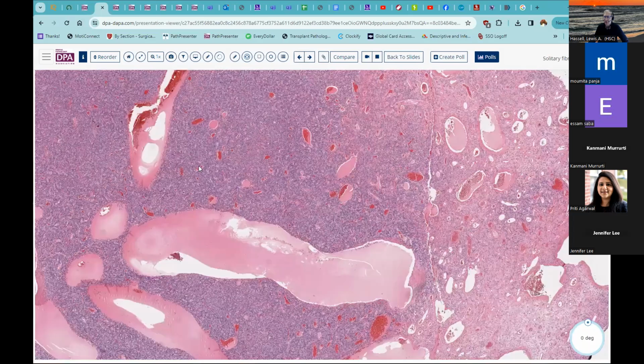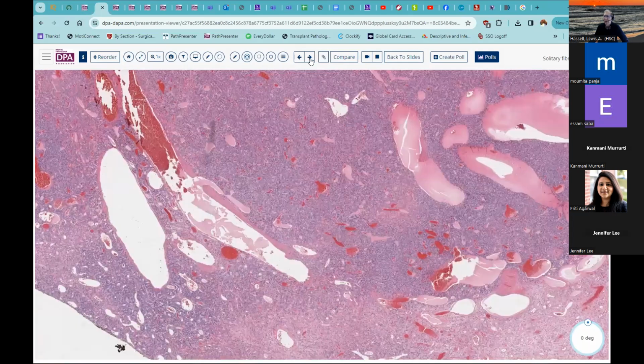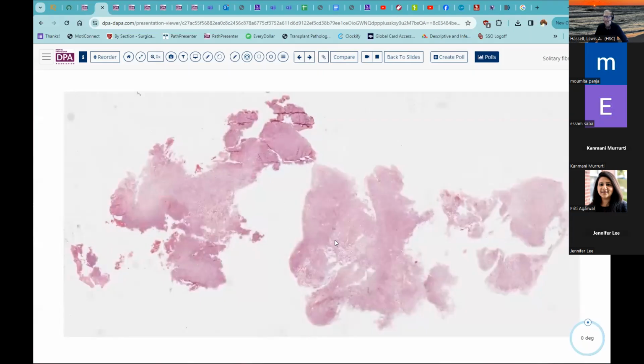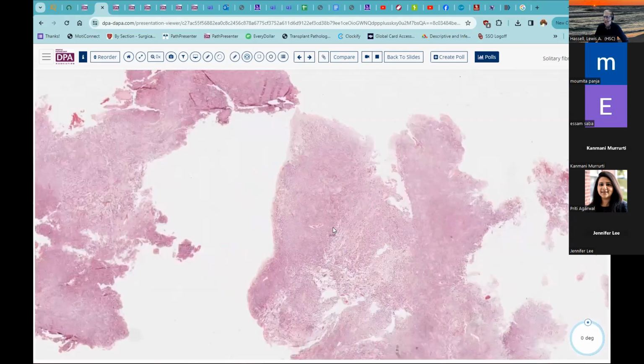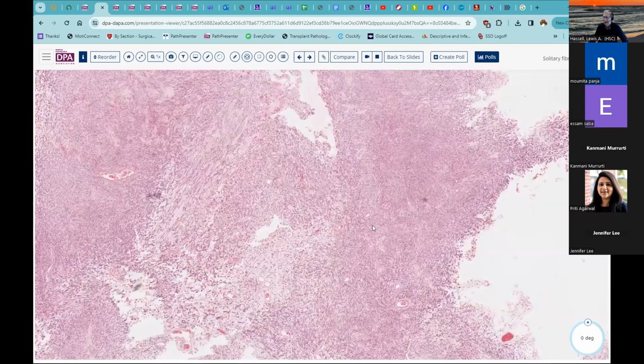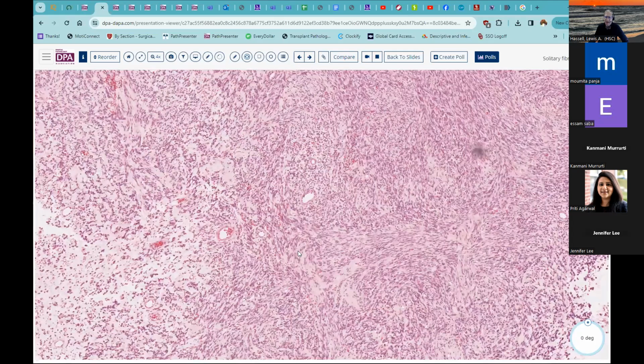So those are some of the histologic, histomorphologic features that we associate with this tumor. I've got a couple of examples, I believe, that show us some of these again in the spectrum. Now, I think in studying any lesion like this, it's very useful to see a spectrum of the kinds of cases that you might encounter in your practice.